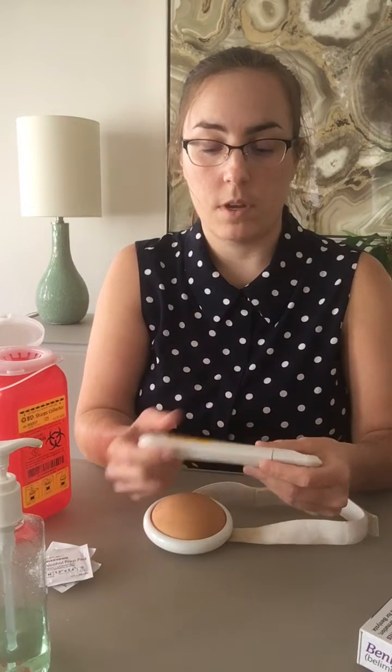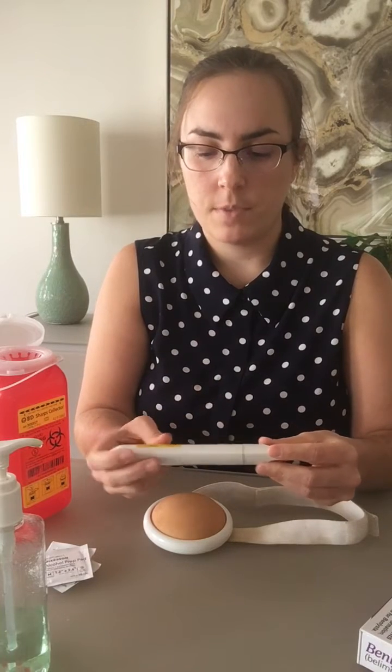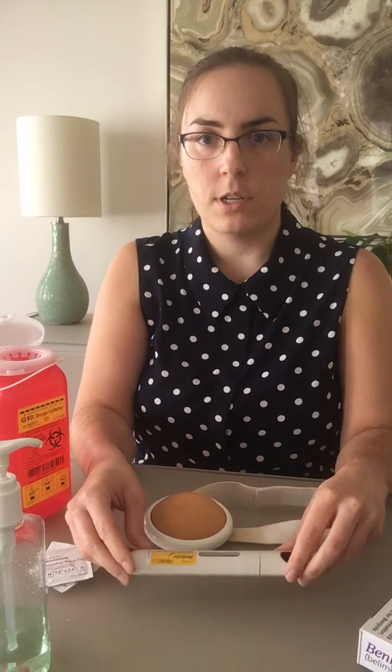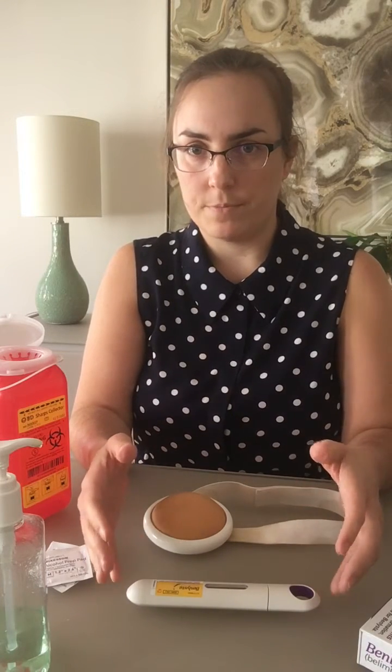This is a demonstration pen, so it's not going to show that. Then what you're going to want to do is take the medication out of the fridge and let it thaw for about 30 minutes. The medication has to be administered at room temperature.